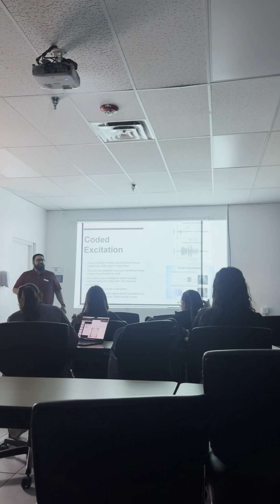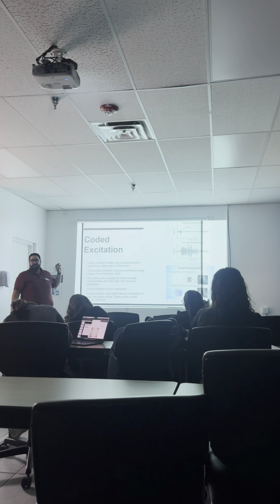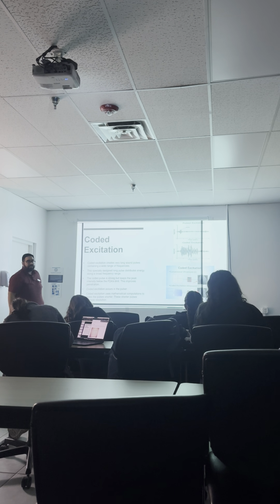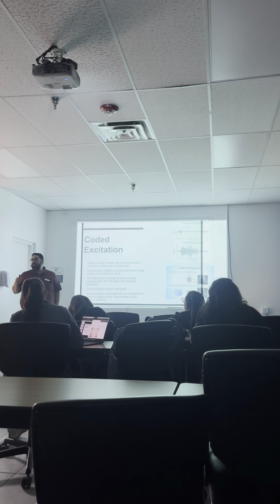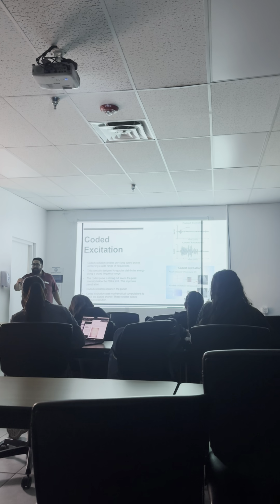Okay, so what it's doing is using a mathematical computation to identify the frequencies that it wants. This is kind of like dynamic frequency tuning, where we use the higher frequencies for the superficial and the lower for the deeper. This is kind of like that, except that it uses a mathematical computation to estimate, well, my focus is at 10 centimeters. What frequencies would I want to use for that?